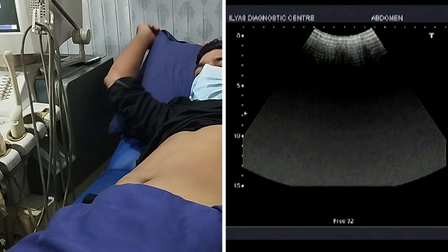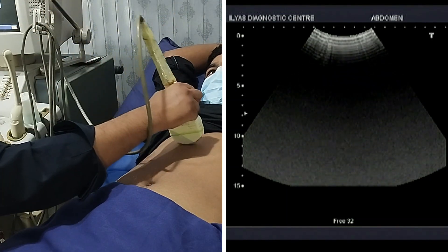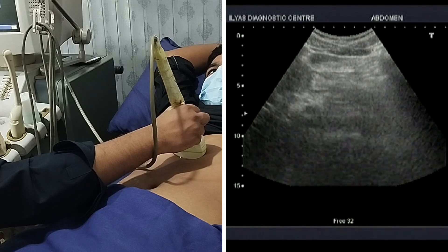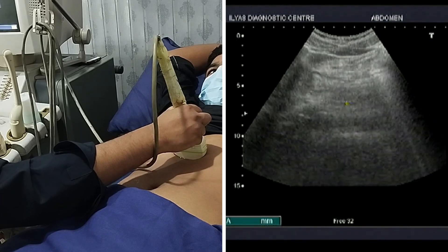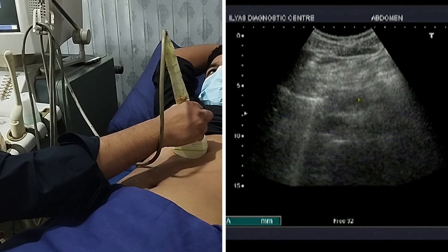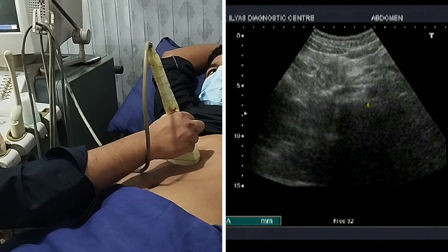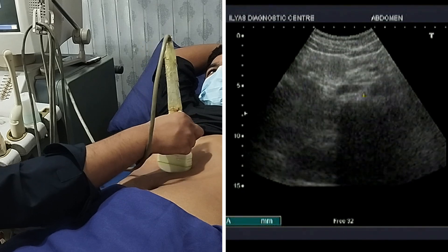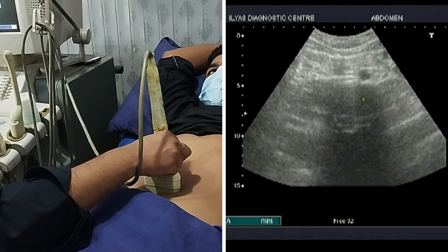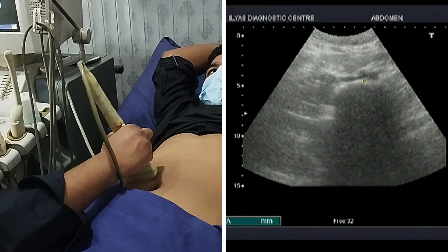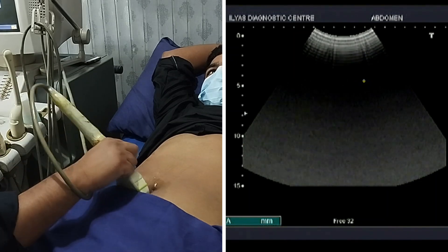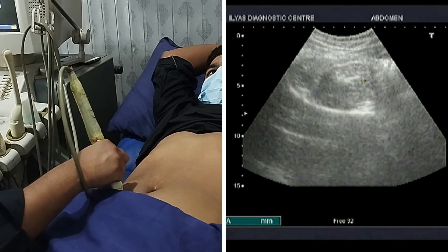Now the last point will be the epigastric region. In the epigastric region I will put my probe and visualize the pancreas. This is the outline of the stomach; behind this is the pancreas, and here is the pulsating aorta — you can see the aorta pulsating here. Moving in the downward direction, in the umbilical region I will evaluate the motility of the gut or any other structure.